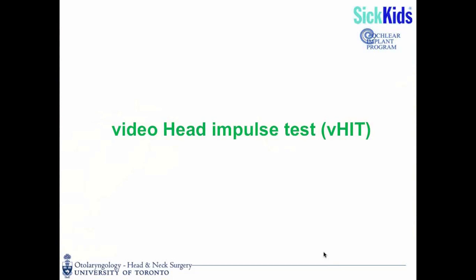This is where video head impulse testing comes in. The two videos that I've shown of head thrust testing were actually recorded. Many clinicians who look after children feel as though they spend so much time and energy focusing on getting the test done that it also becomes difficult to interpret the test as they're doing it. So up until we had video head impulse testing, we would record the head impulse test with a video camera in order to look at it again, to play it back, to play it in slow motion, because you spend so much time and effort entertaining the child and getting the test done that it also makes it difficult to make the assessment as the clinician.